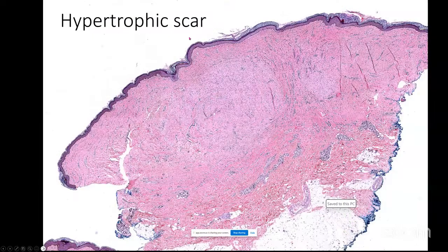Hypertrophic scar, nodular fibrosis, usually in the background of regular scar. So scar, you usually have parallel orientation of collagen with epidermal effacement and increased small vessels. Early on, they're going to be up and down. And then with hypertrophic scar, it becomes more nodular.